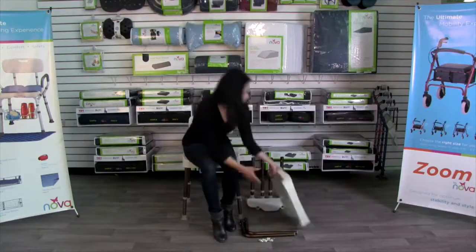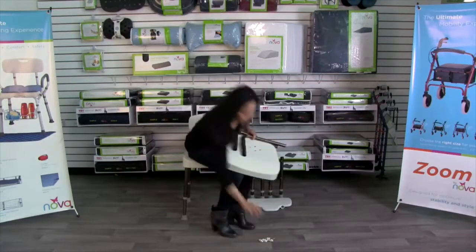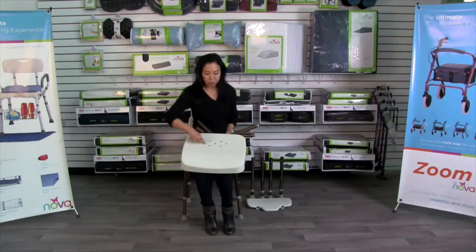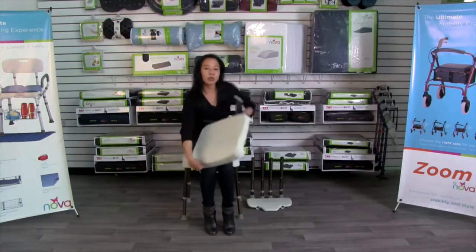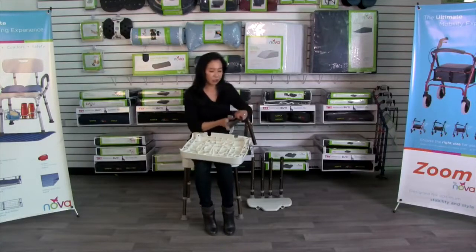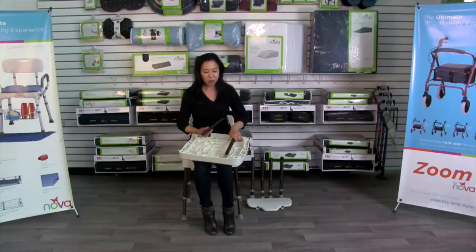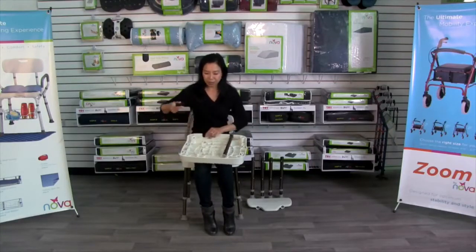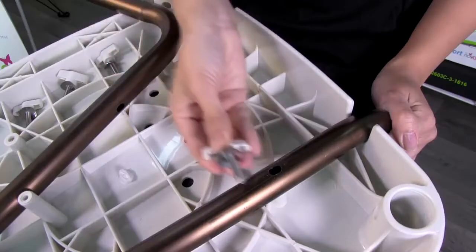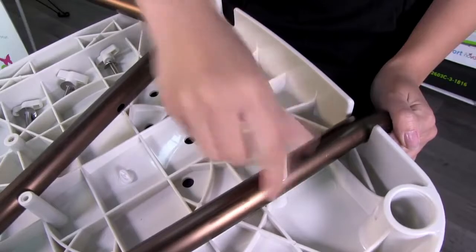You'll also find the backrest attachment and four screws and washers. With the drainage holes towards you, turn it over — this is where you'll install the back inserts. There are two holes in the tubes and they will line up with the screw inserts on the back. Take each screw with the washer and insert them into the screw insert.